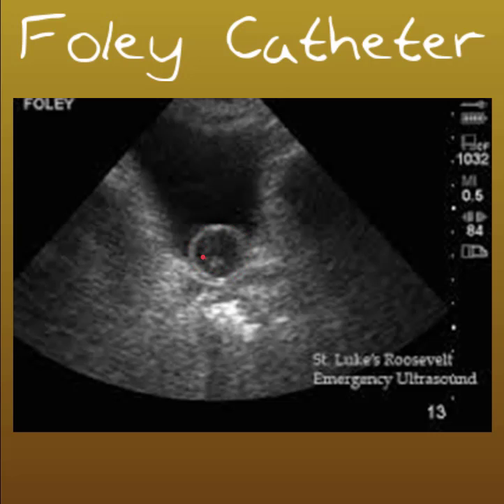There's a second tube that they can inject saline into to inflate this bubble. So this is a little plastic bubble filled with saline, and that's going to help keep the catheter in place. There's actually a channel within the bubble that connects with the catheter tubing that allows the urine to exit the bladder.